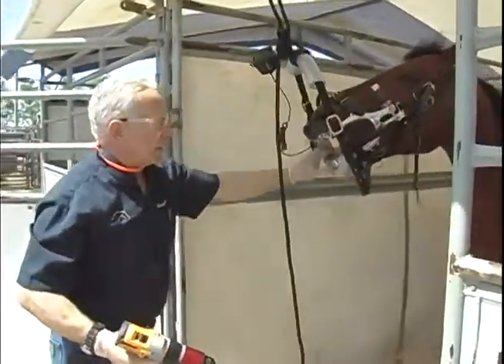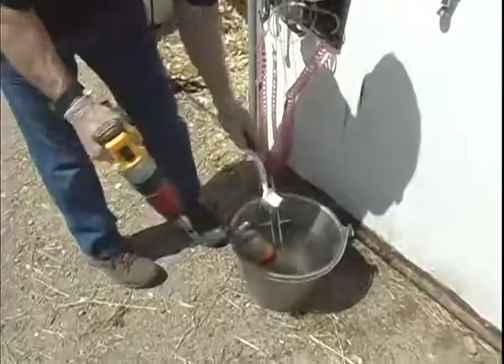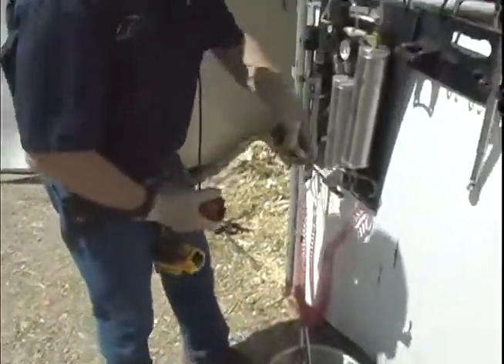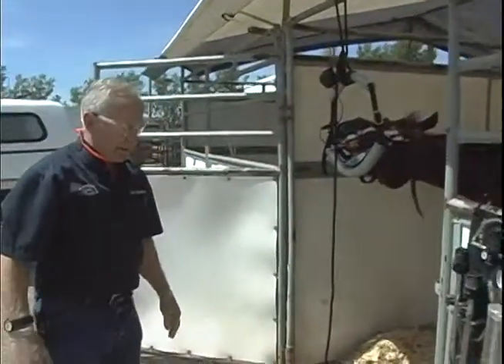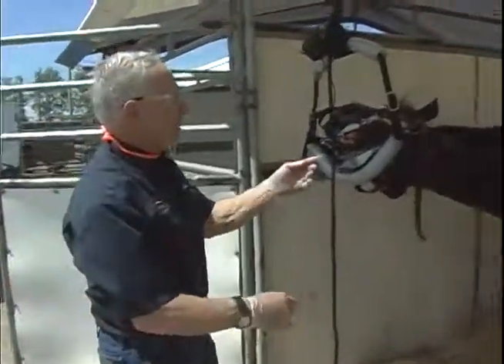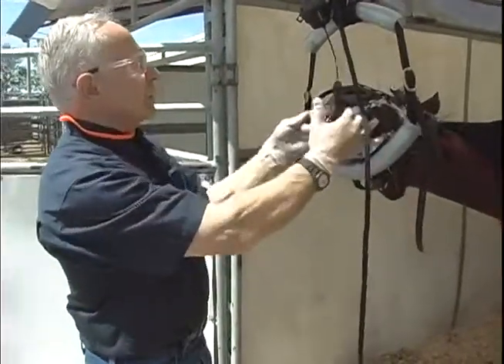This horse is very lightly tranquilized. This is only for demonstration purposes. And basically I would have finished the float this way. Then I'd wash the mouth out, re-examine the mouth and do what is necessary.